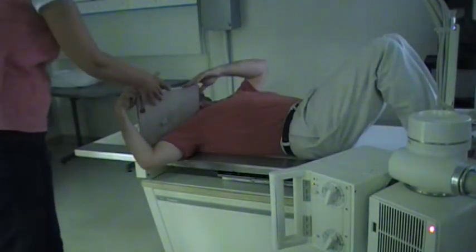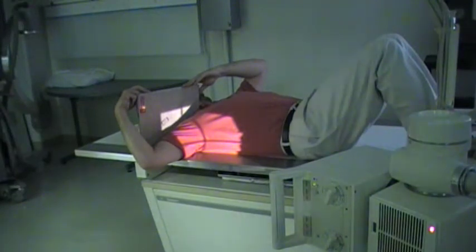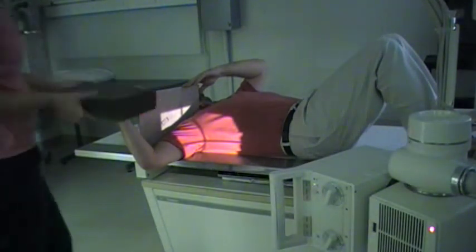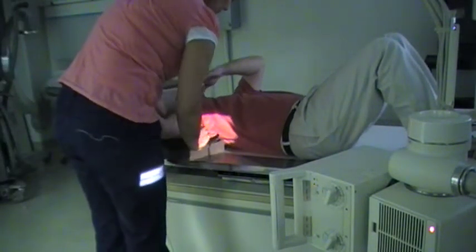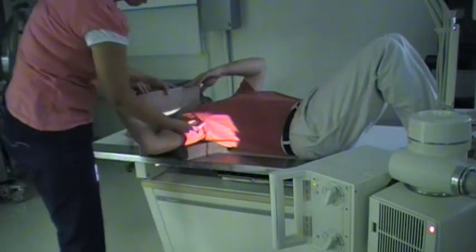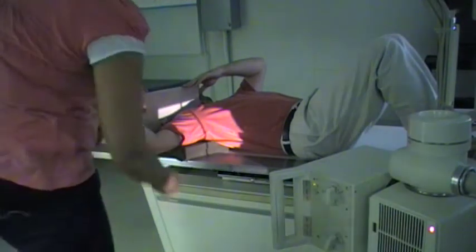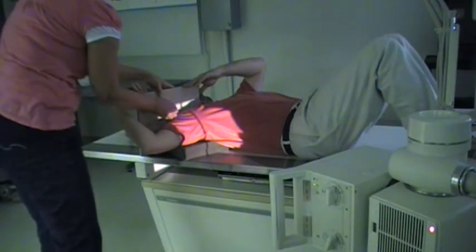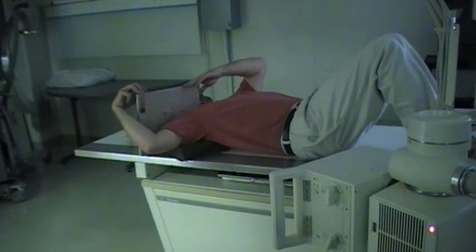Just make sure the cassette is good and straight and not tilted. Another option, if your patient does not have much meat on the arms, you can prop a sponge up underneath there — that helps prop up the area better away from the edge of the table. This is the inferior superior projection, also known as the axillary or the Lawrence method, showing the shoulder joint and the glenoid cavity.